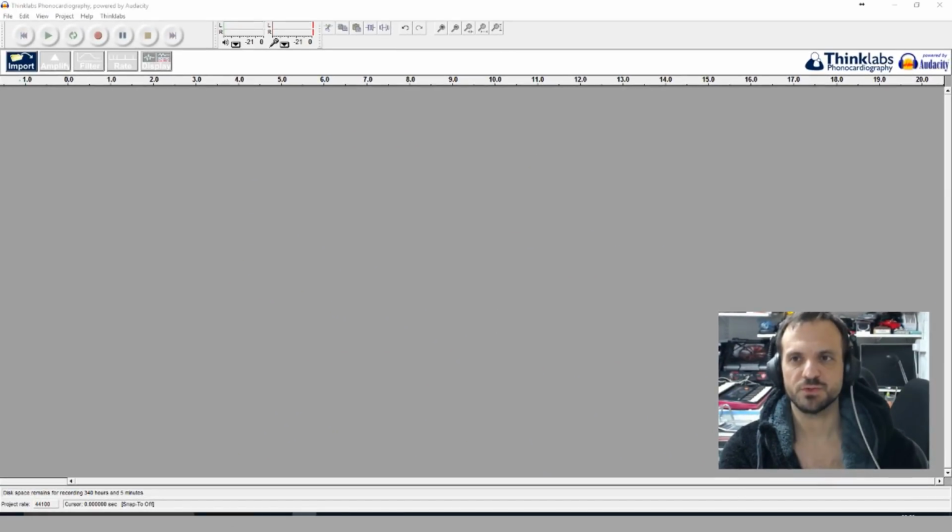I'm just going to show you some software. Now, I normally use Audacity, but there is a version of Audacity that's been tailored to make it easier for people trying to do this. If you've got the regular Audacity and you know how to use it, you can do everything you need and a lot more than you can with this Think Labs version. But I'm just going to show you the Think Labs version.